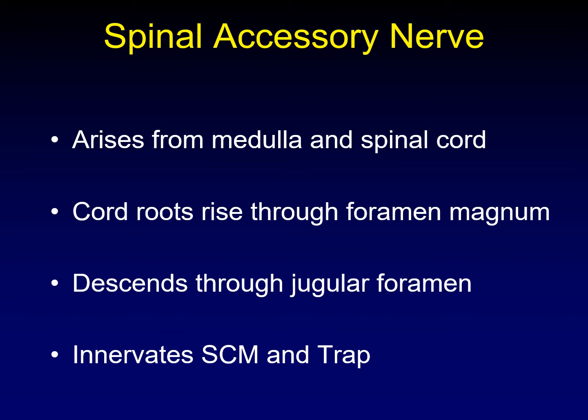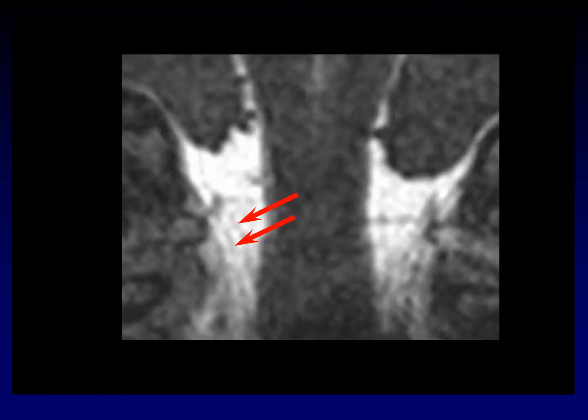Once it leaves the jugular foramen, it is responsible for innervating the sternocleidomastoid muscle and the trapezius muscle. Here is a coronal image in steady-state free precession showing the small rootlets from the spinal cord extending up through the foramen magnum to form the 11th cranial nerve.